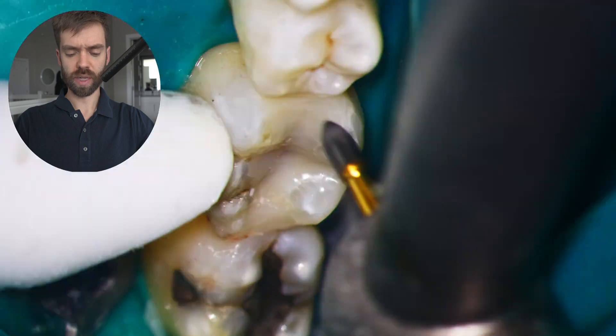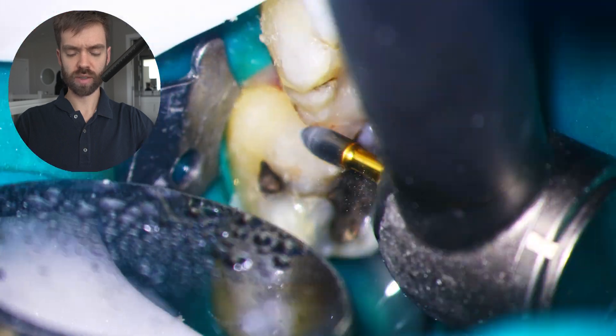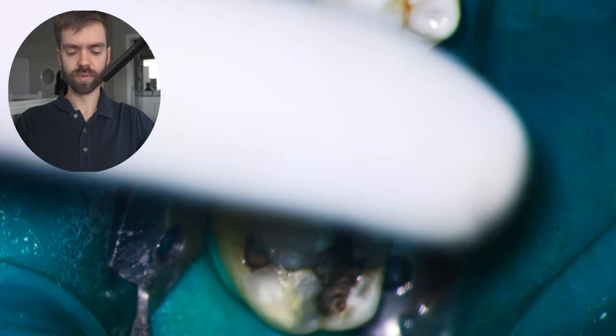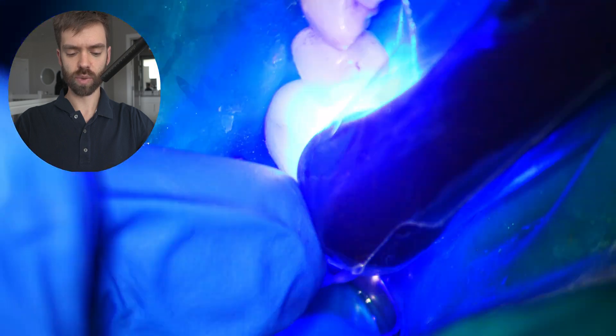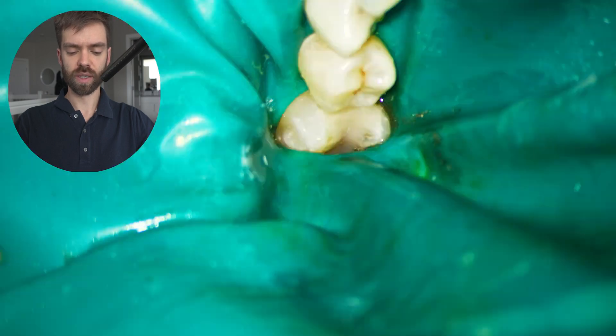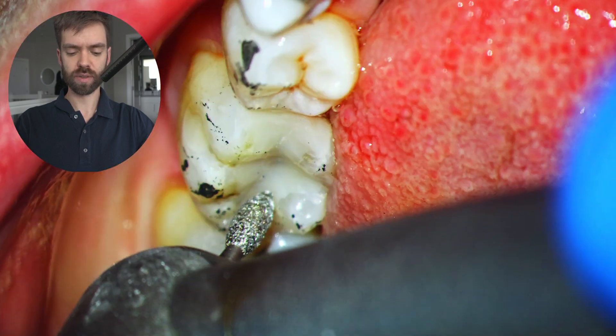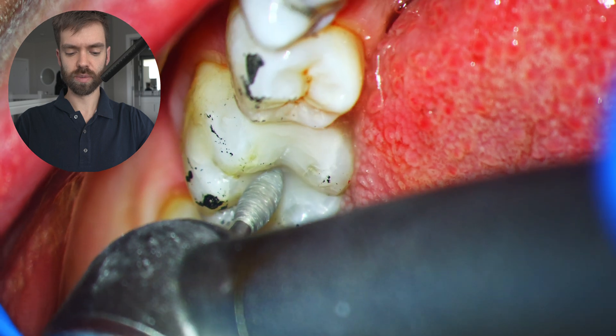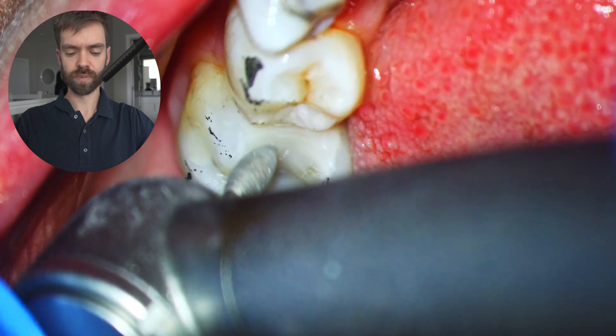We're just trimming things up, making it look nice and pretty. And there you have it. That is pretty much done. We just want to make sure those flossing contacts are perfect. Do our final cure and then we just go ahead and take the dam off and adjust the bite. Make sure things are looking great. And that's it.